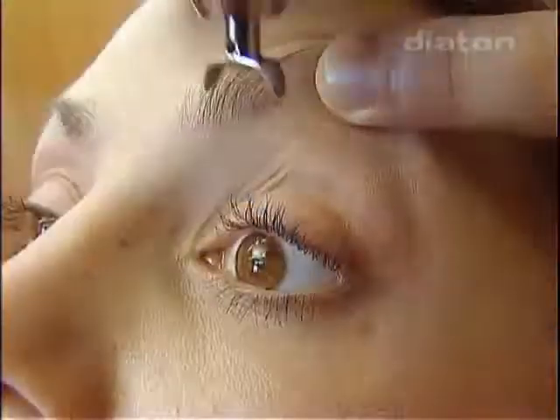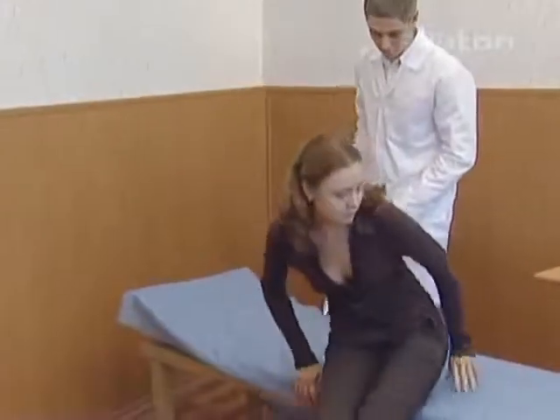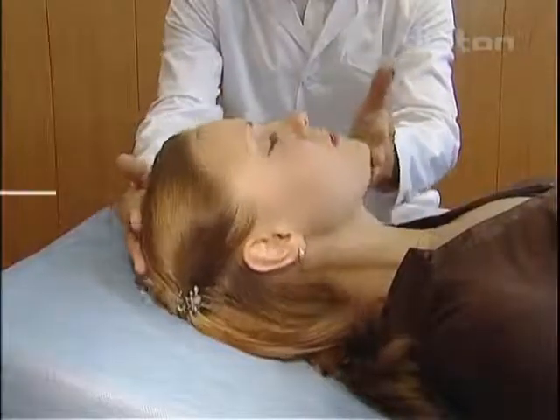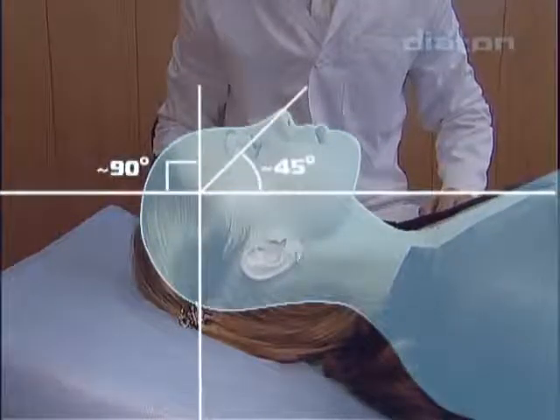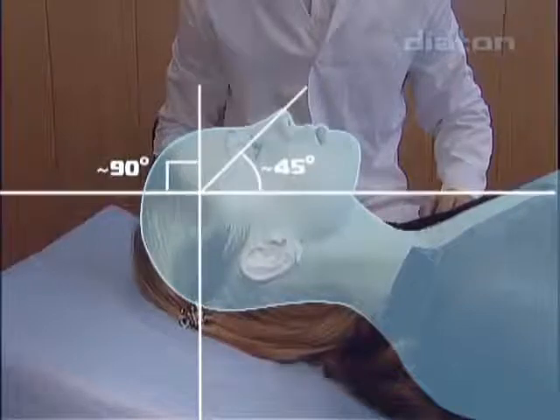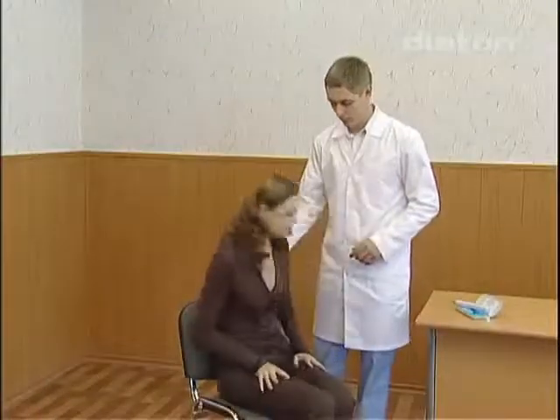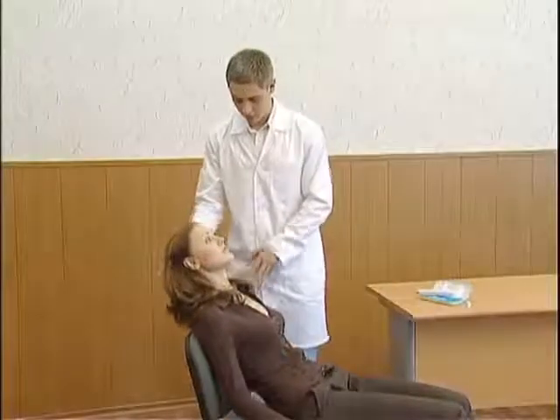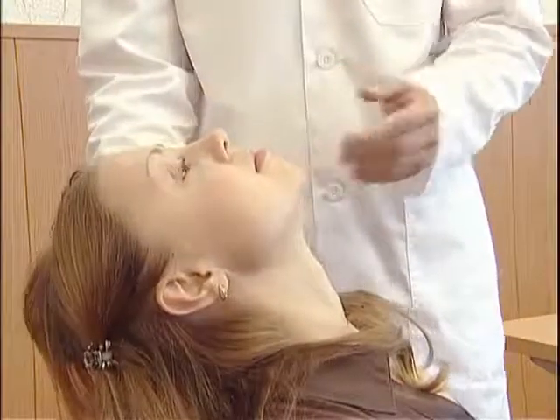Intraocular pressure measurement is possible in a sitting or reclining position. For valid IOP data in dynamics, measurements must be made in the same position each time. The patient's head must be placed horizontally. If the measurement is made in a sitting position, the patient's head must rest horizontally on the head support. If a head support is absent, settle the patient in a chair with their back tight against the chair back and place the head horizontally.